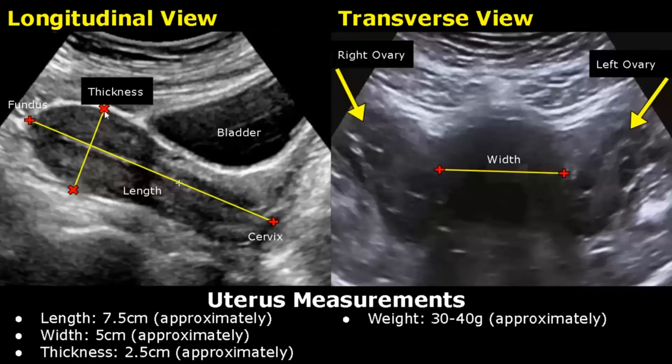In the transverse view, we can measure the width of the uterus. We can also see the right and left ovaries. The normal uterine width is around 5 cm.